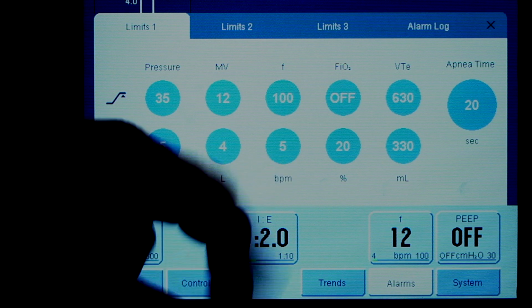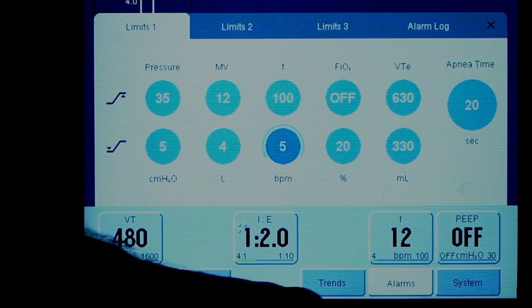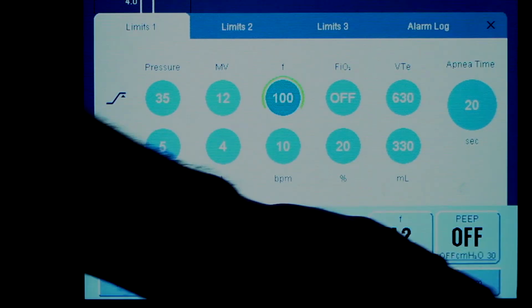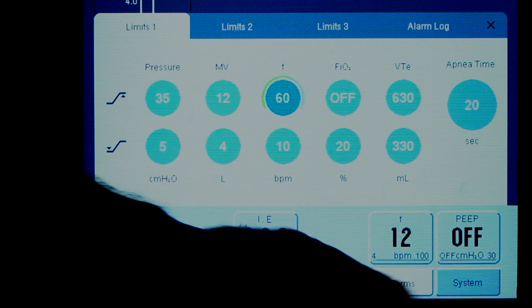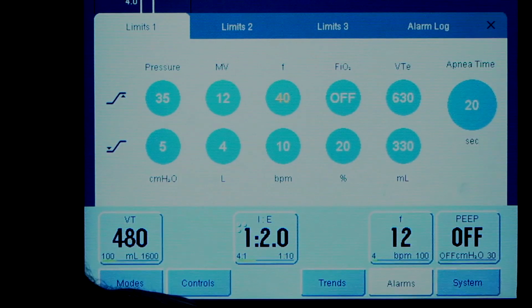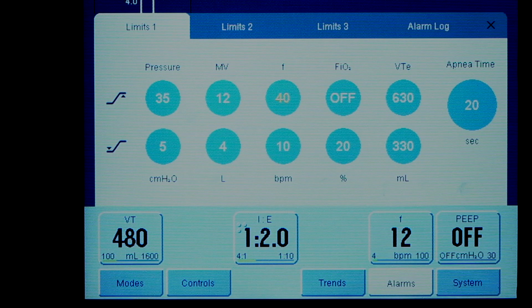Next thing we have is the respiratory rate, and you can see here this defaults to a low of 5 and a high of 100. This doesn't really suit our practice, so again, we're going to recommend a low of 10 and a high of 40. As you can see throughout this, the screen is touchscreen, and you use the dial and the knob to press to select your requirement, but the majority of this can be done simply by touching the screen.